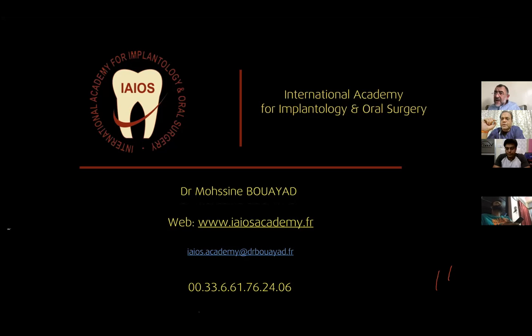Yeah. Okay. And when I have a micro perforation, as you know, when you put the CGF or a PRF into the sinus, you have healing of the membrane after a few days. So you can also put your bone grafting with your MPM or sticky bone, because the PRF holds the bone, and in the time of healing, the Schneiderian membrane is held too. Now you don't have the bone in the nose.